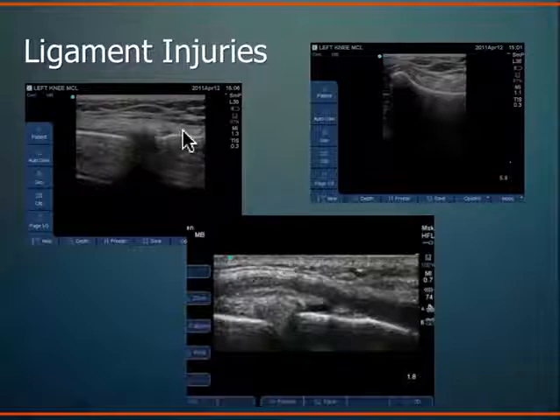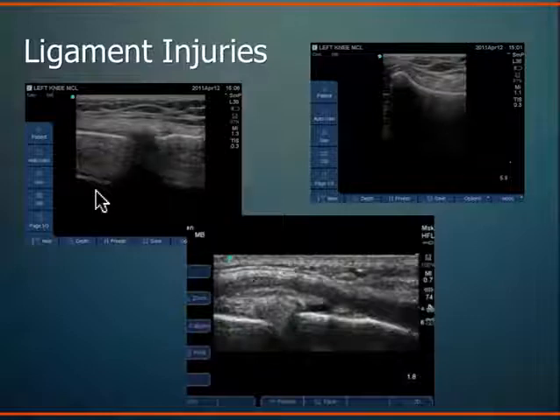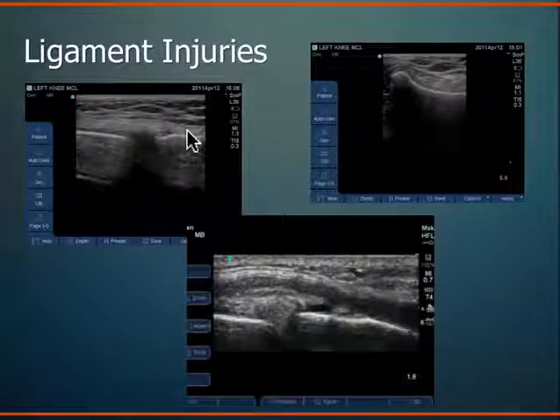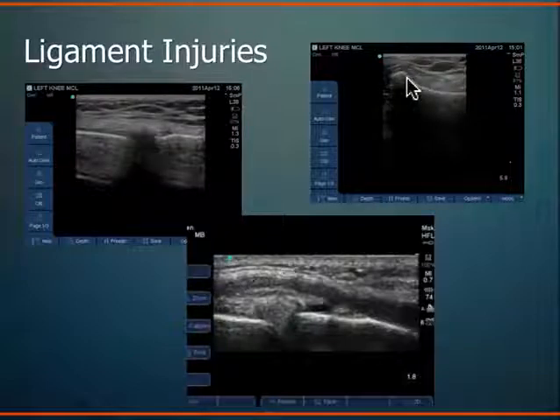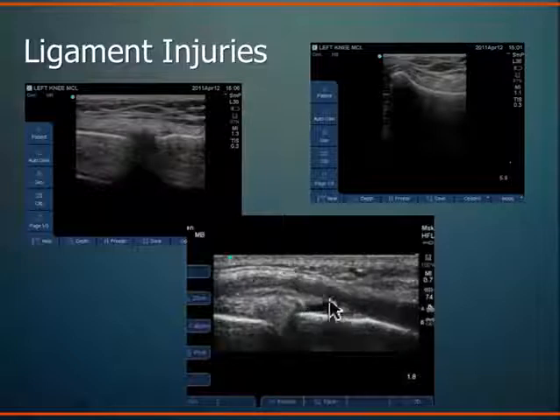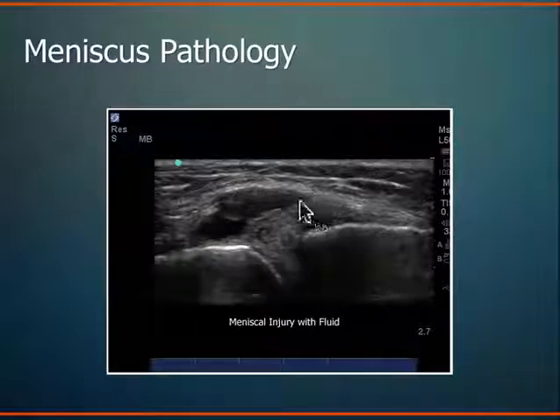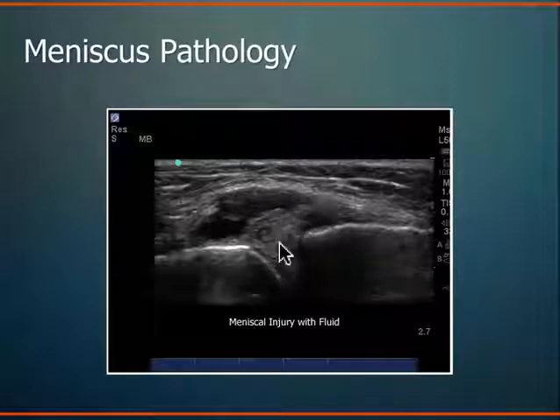For ligamentous injuries, this depicts a normal MCL. The joint space here, femur, tibia, and MCL. Ligaments look very similar to tendons — fibrillar pattern — but a little more hyperechoic and dense. This is the dense ligament structure coming across, proximal femoral condyle, MCL going distally. This is an example of MCL tear — a distal MCL tear. The joint space here, MCL coming across, then you see disruption of the tissue and distally no longer any ligamentous tissue — retracted proximally. Very well seen on ultrasound. Regarding meniscus pathology: the joint space, femur and tibia, joint capsule fusion. You can see distension of the intra-articular fluid and this meniscus that is displaced with meniscal cysts. There certainly are deeper zones of the meniscus you can't quite image, in which case you rely on MRI.